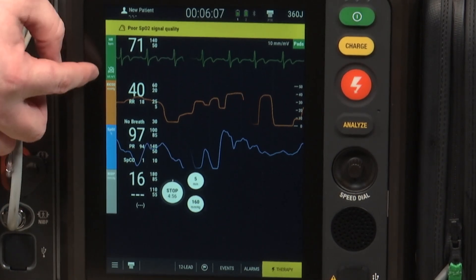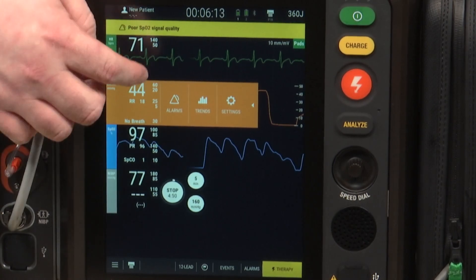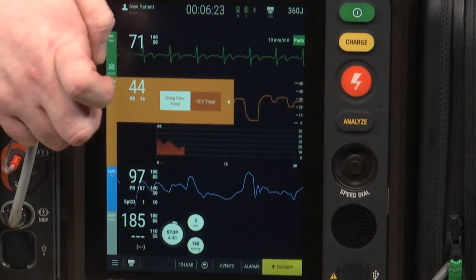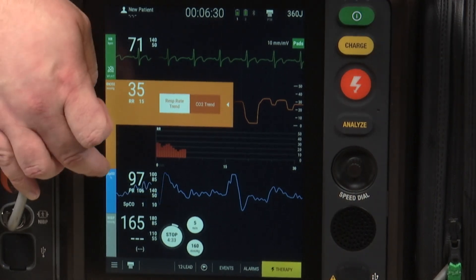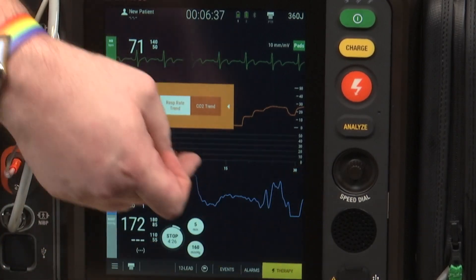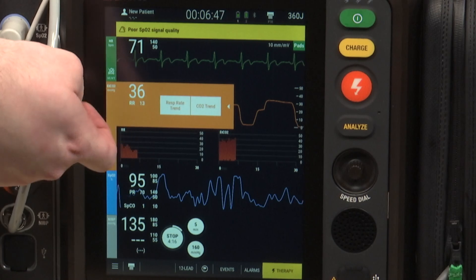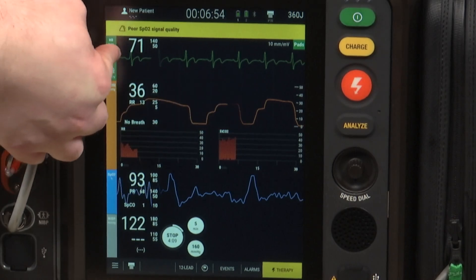Moving down to end-tidal CO2, you can again set your alarms and look at trends. With trends, I can look at the respiratory rate trend or the CO2 trend. If I click on respiratory rate, an orange graph comes up showing the trend of respiratory rate with time going across the bottom and rate going up and down vertically. If I click CO2, I can see both trends right next to one another on the screen.